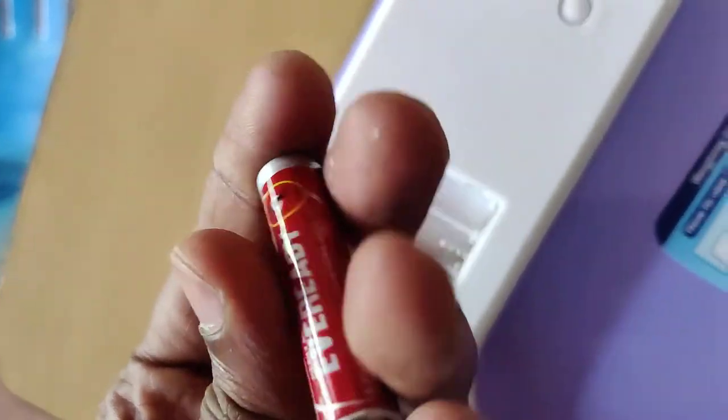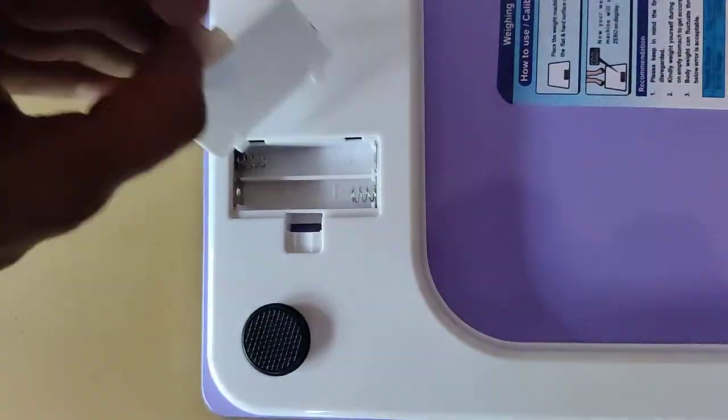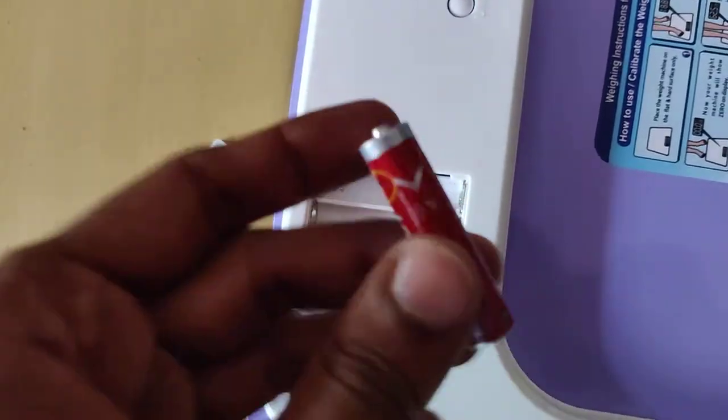You must take two batteries. Using your finger, simply remove this and take out the batteries. This small kind of battery — this is the positive side and this is the negative side of the battery.